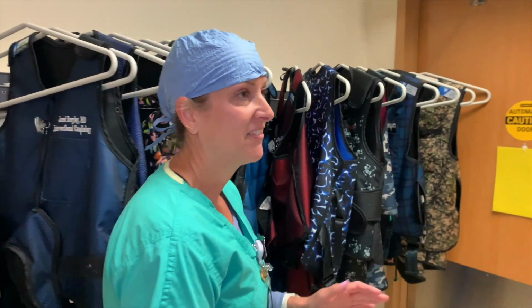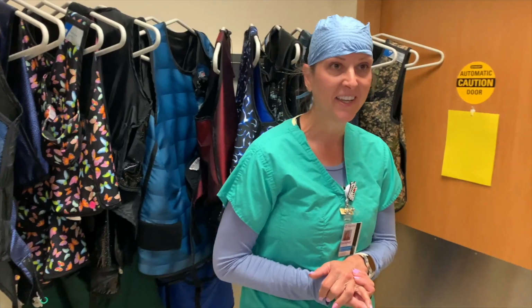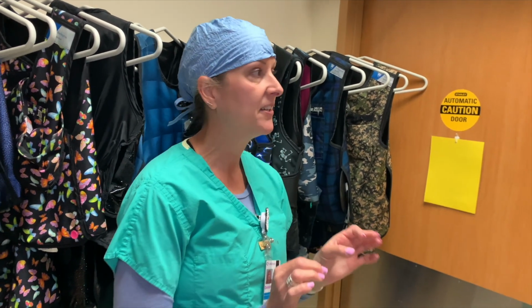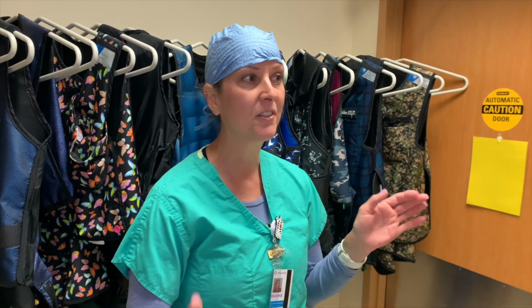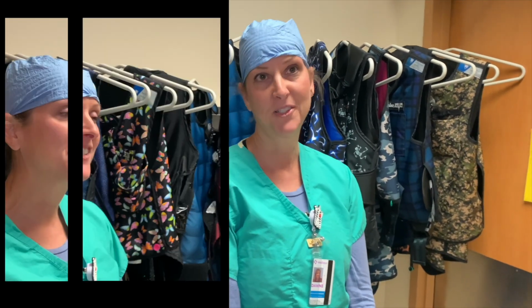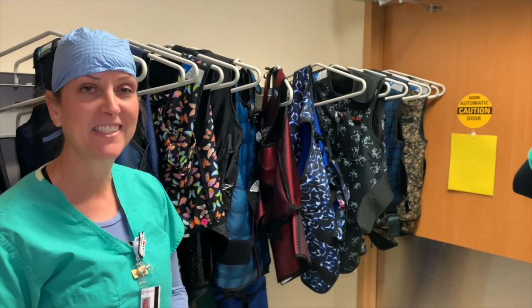We actually have a patient on the table right now. So right now what you hear is they're setting up the patient, setting up the equipment that we use on the patient. Here it's super important that you don't have any air in your lines, that kind of thing. So they're clearing all of the lines for everything that's going to be used on the patient to make sure we're safe.